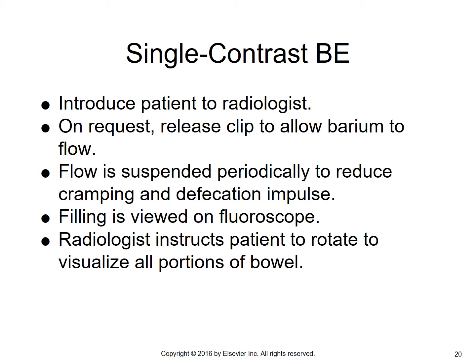For single contrast barium enemas, you're going to introduce the patient to the radiologist. So once you've got them on the table, you've got the enema tip in, the radiologist is going to come in and you're going to say, Mr. Smith, this is Dr. Brown. On request, the radiologist is going to come over, pull the image intensifier over the patient, take a quick look before any barium goes in, and then the doctor is going to tell you basically what to do. So on request, you're going to release the clip to allow the barium to begin to flow.